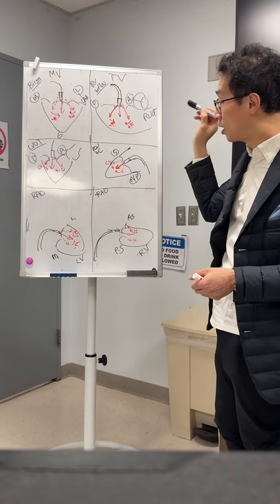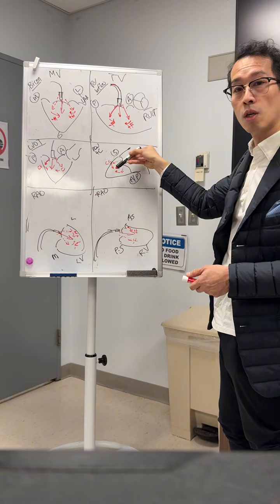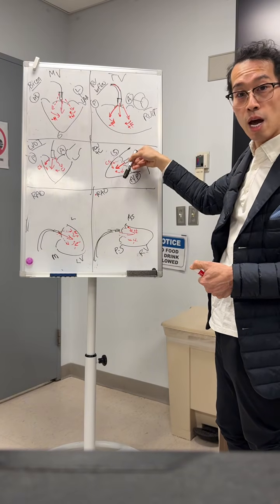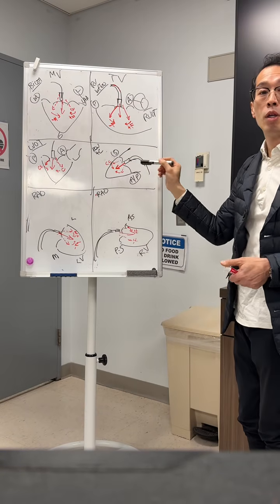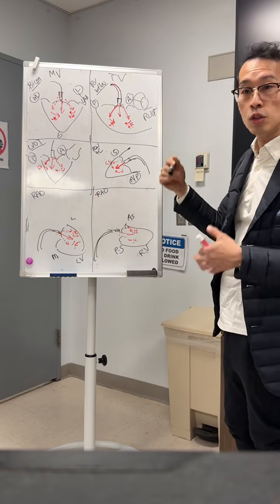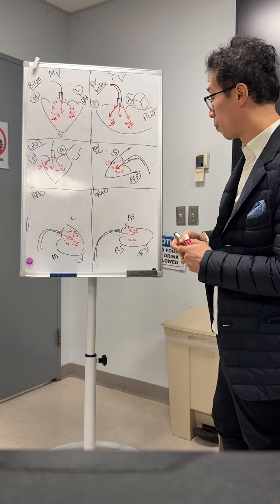Now the tricuspid is exactly the same principle. If you're doing a septal dive, you counter-clock to go lateral. If you're going towards the free wall, the lateral side, you clock to bring it towards septal. Okay, so again, you can see how the parallel in terms of the imaging and the steering of the devices match each other, at least with this system.